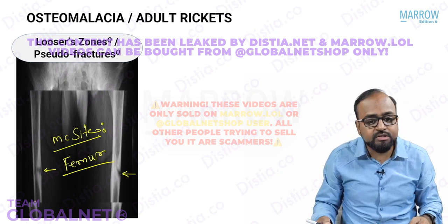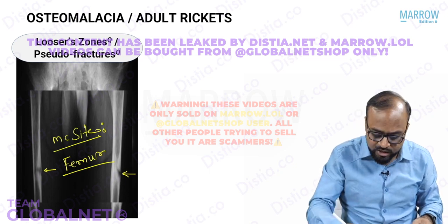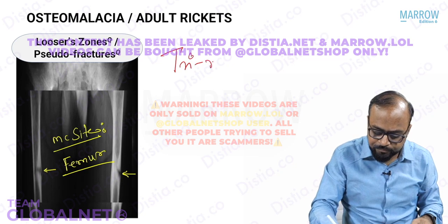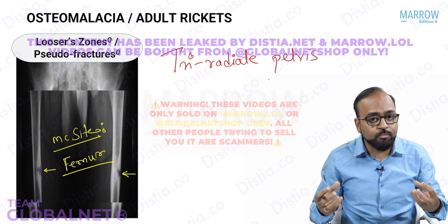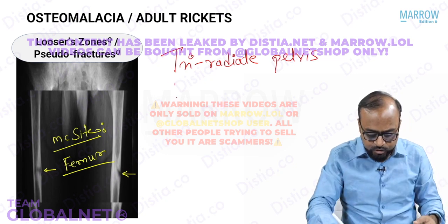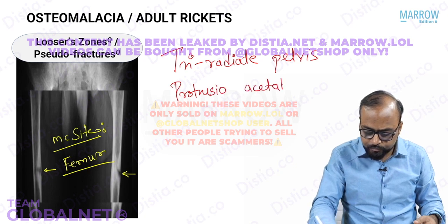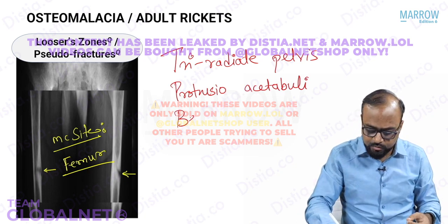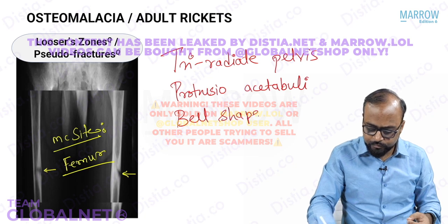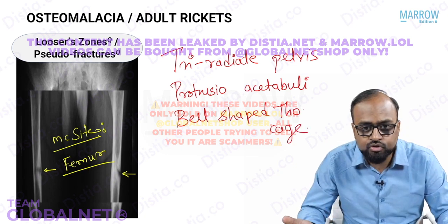Now, along with this, what is seen in osteomalacia is a typical appearance of the pelvis, which is called a triradiate pelvis, because the bone has become soft, bone has become weak. The acetabuli protrude into the pelvic cavity, so that is called protrusio acetabuli. Protrusio acetabuli, triradiate pelvis. Bell-shaped thoracic cage is also seen. So these are all features of adult rickets or osteomalacia.